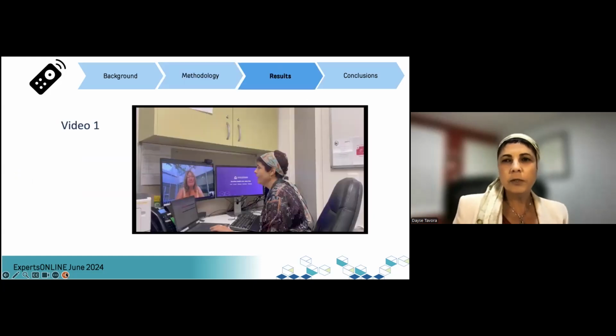So what Alex introduced is the idea that you can help these patients without them coming to the center. What, in my experience, goes one step ahead, because what we want is to use this technology to replace our conventional remote programming. We are going to do exactly the same thing, but we don't need to send equipment, and we don't need somebody on the other end connecting.